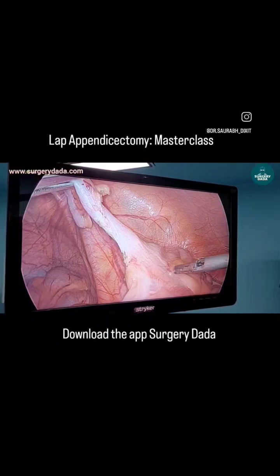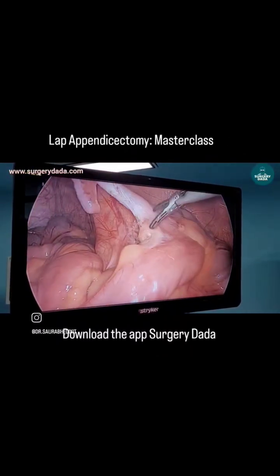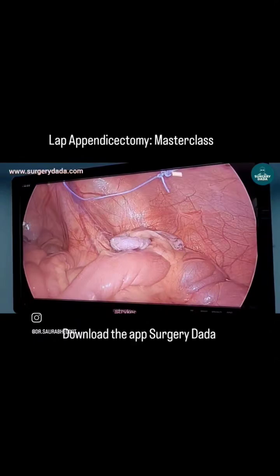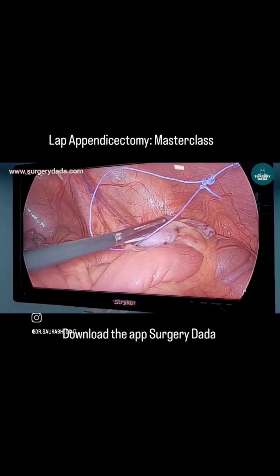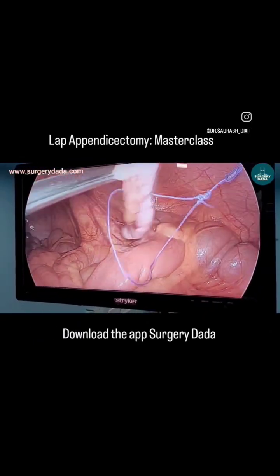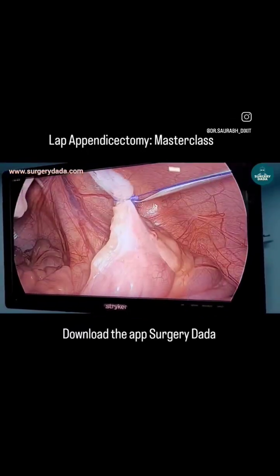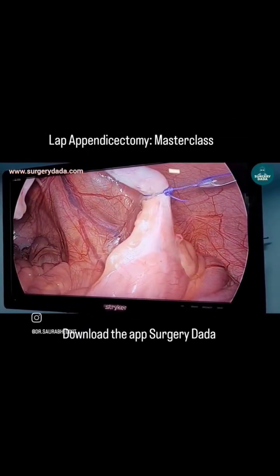This critical view of safety is really very important. Once you secure this, it is time to tie a knot. We prefer to use the SD's knot, which is a 2-2-2 configuration of 2 throws, 2 winds, and 2 locks. You can see a perfect dumbbell configuration has been created.